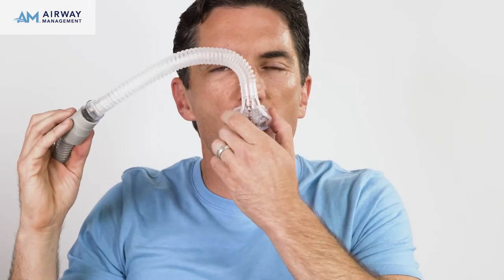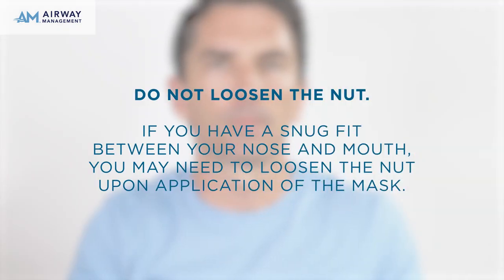Make sure that the mouthpiece is centrally located to your nose. If it is not, you will need to repeat the mouthpiece fitting process. When waking up, you may remove your mask as is in one piece — do not loosen the nut. If you have a snug fit between your nose and mouth, you may need to loosen the nut upon application of the mask.